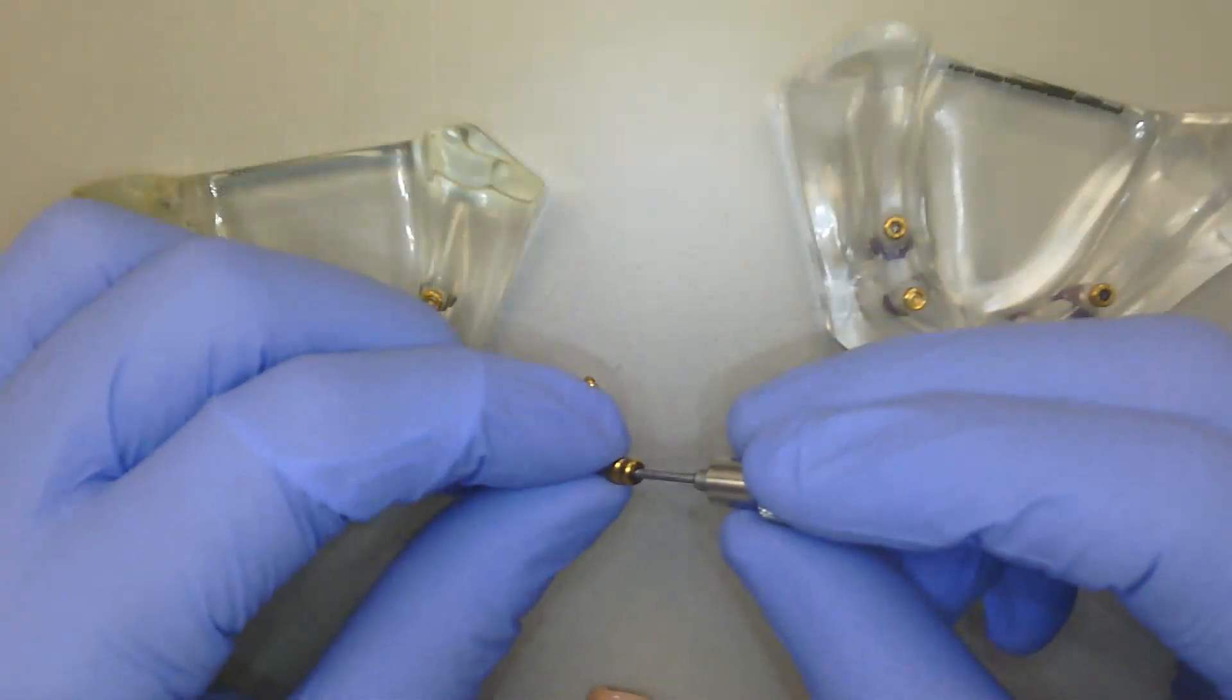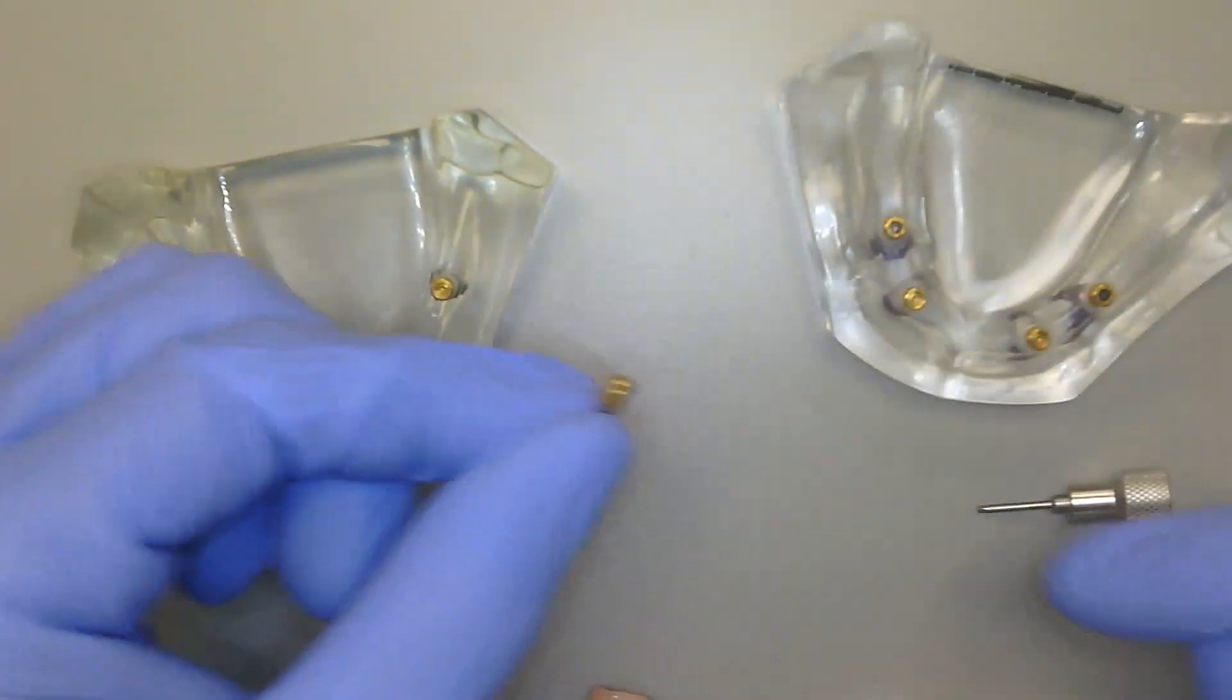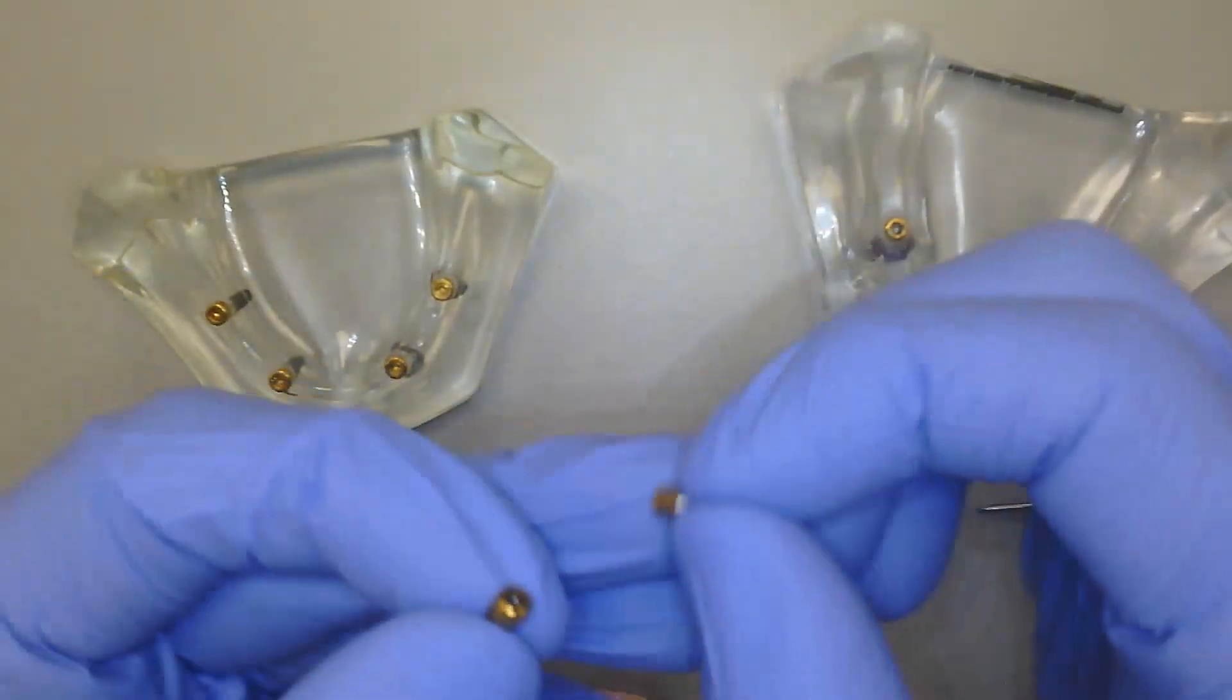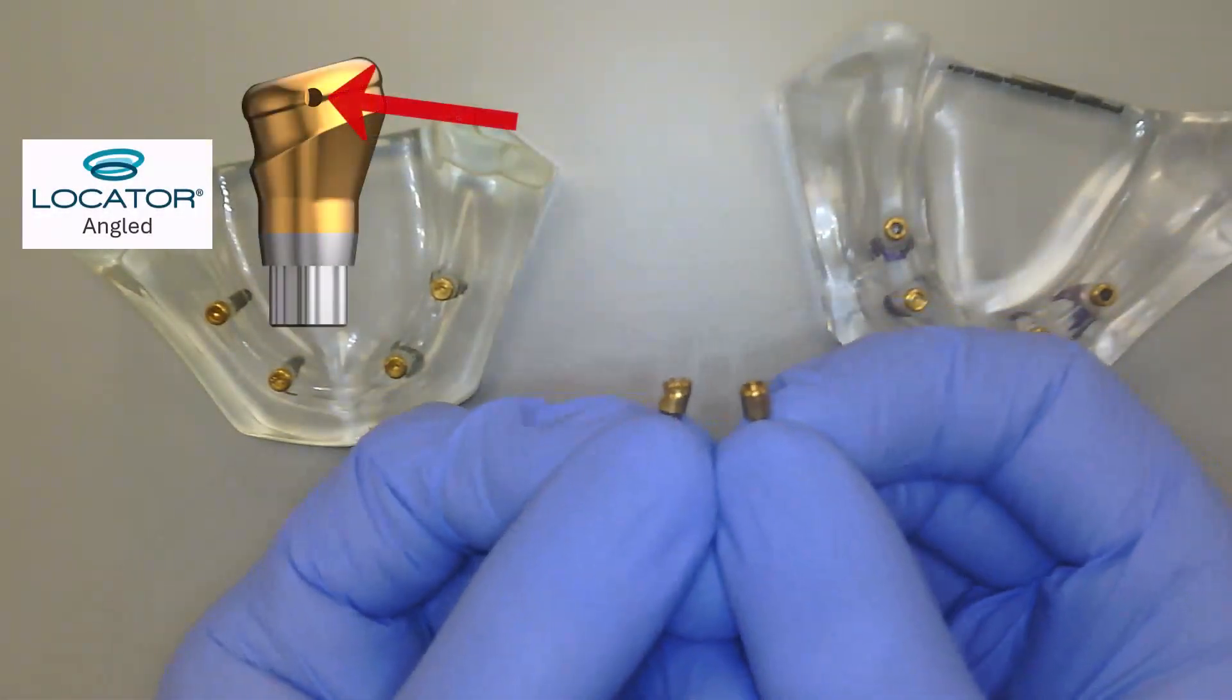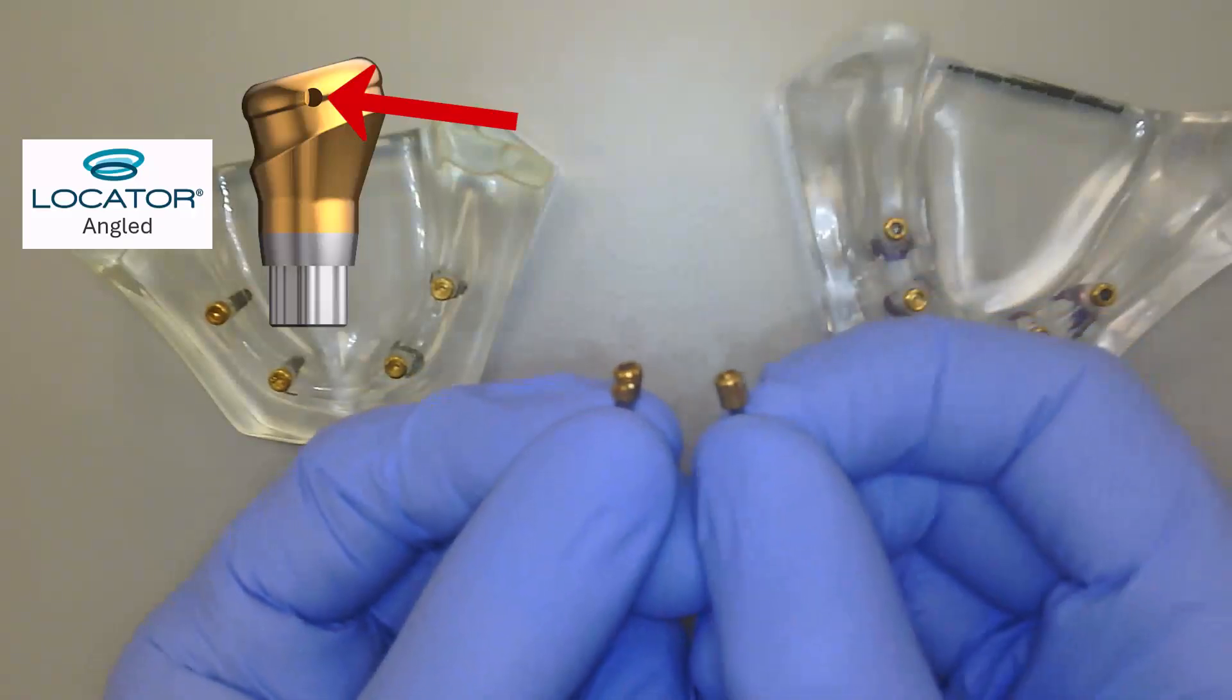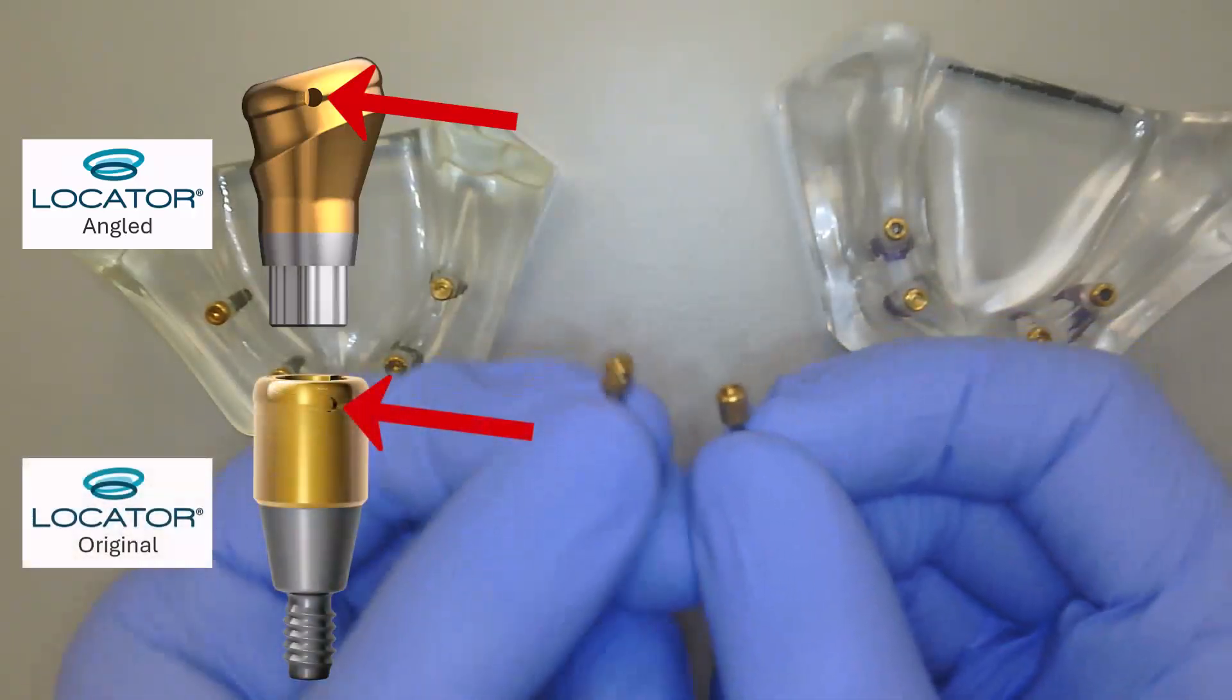Additionally, this allows me to utilize the same exterior geometry that we would have on our locator abutment. In addition, it also has this tiny little hole on the side of the abutment that's called the weep hole. That is the same between the locator and the locator angled.